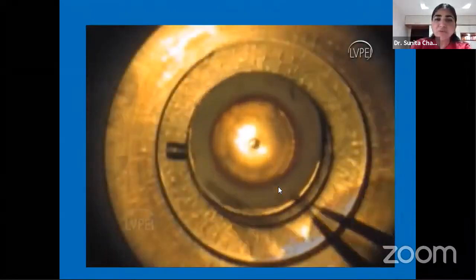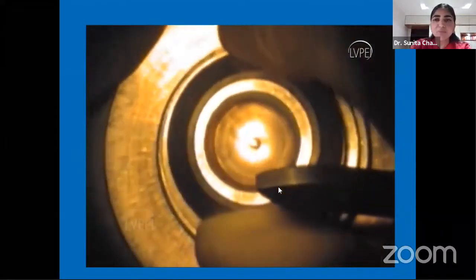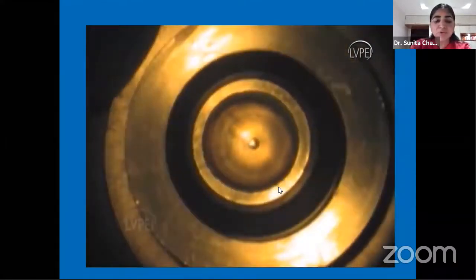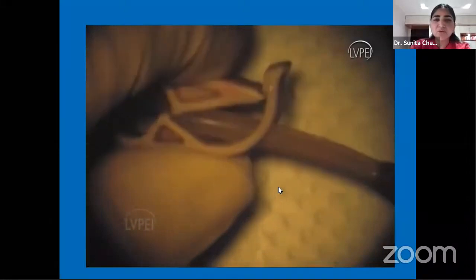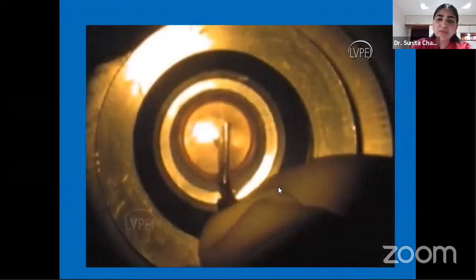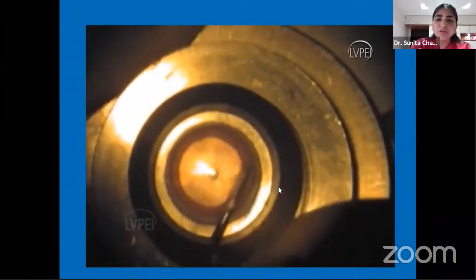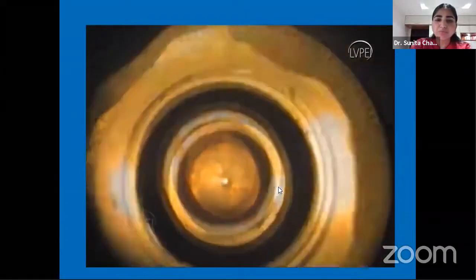Let's look at this video, and this is using the metal artificial anterior chamber. The cornea is placed. One can use BSS. You can also use the MK medium or whatever Cornisol medium or Optisol. And this is a dual lock to stabilize and make sure the chamber pressure is adequate. One important thing is that the guard of the blade should be towards the cornea, not on the conjunctiva, so as to ensure an adequate depth.